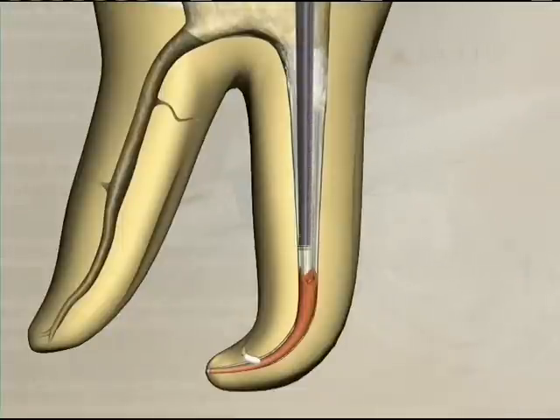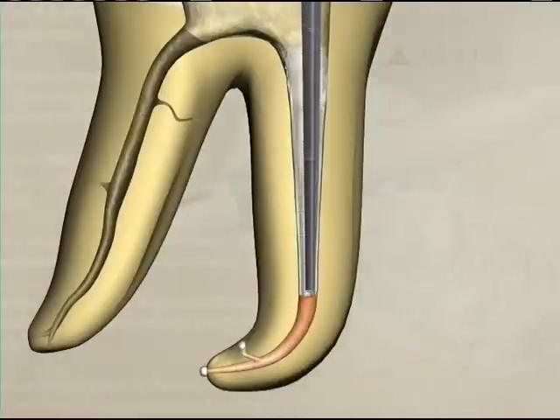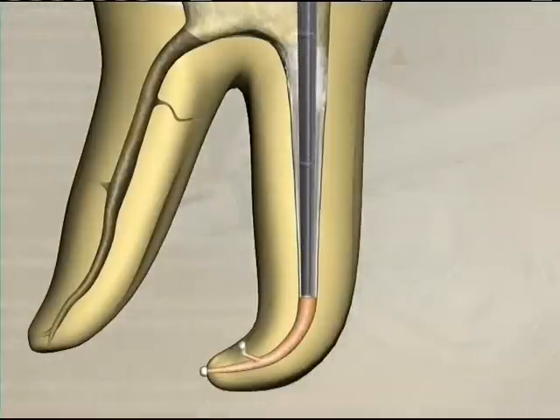Again, a pre-fitted plugger is inserted to circumferentially compact the remaining gutta percha. In this animated example, the plugger pushes the gutta percha within 5 or 6 millimeters of the apex. The plugger is again held against the gutta percha mass as it cools.